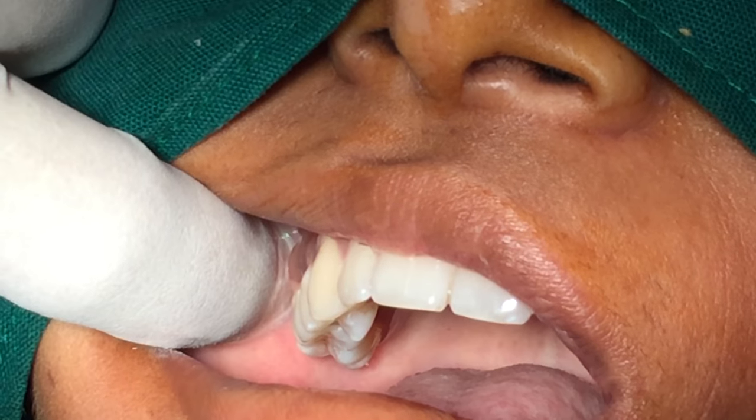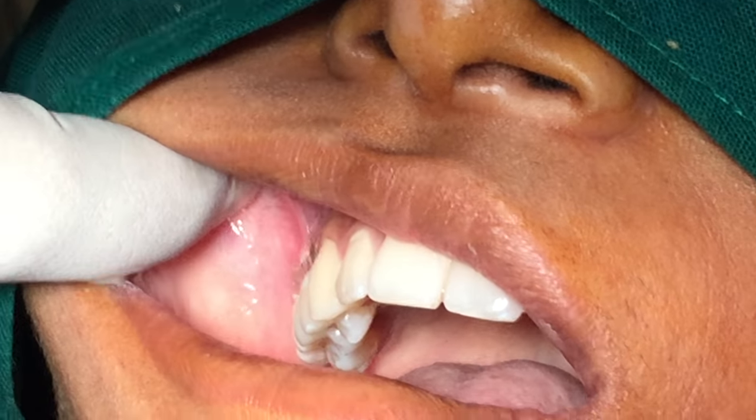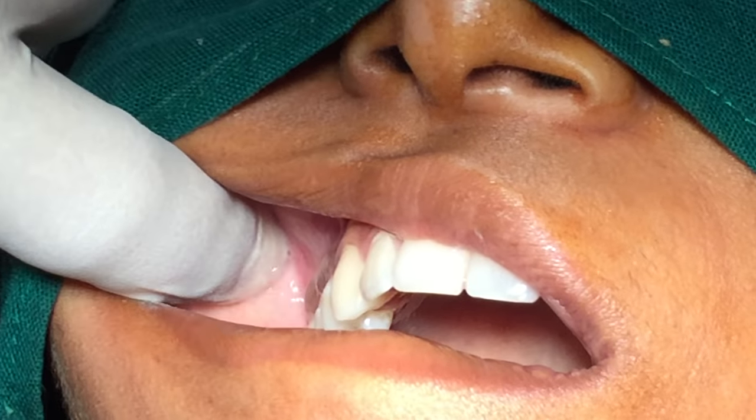Anatomical landmarks for this block are the mucobuccal folds, the zygomatic process of maxilla, the infratemporal surface of maxilla, and the maxillary tuberosity.